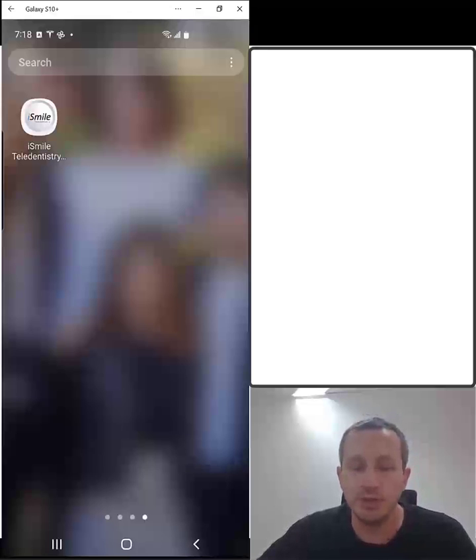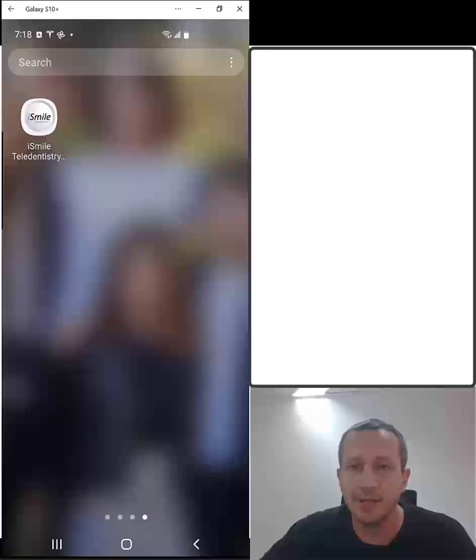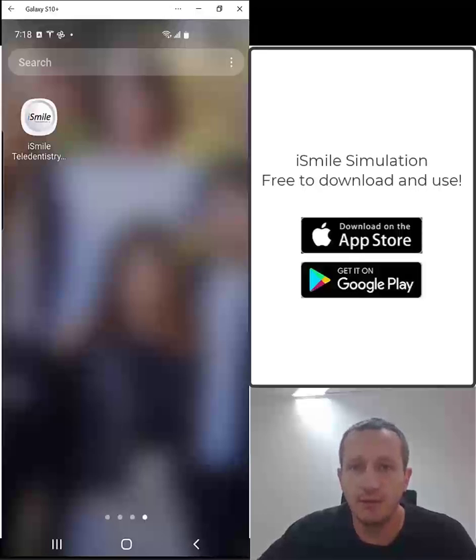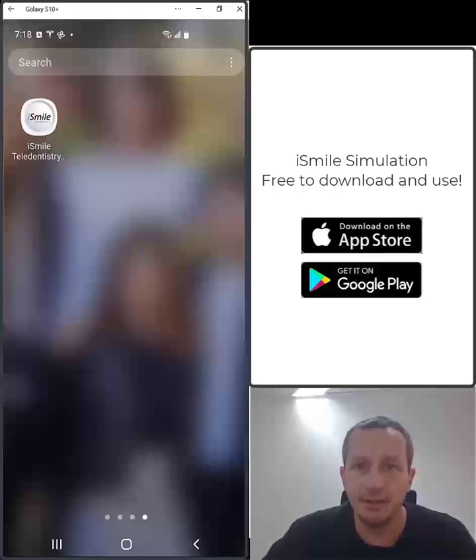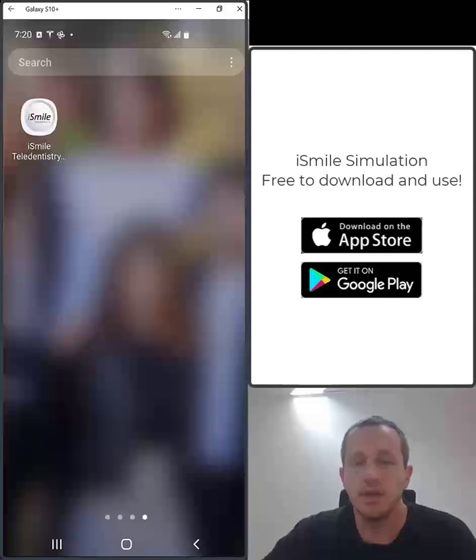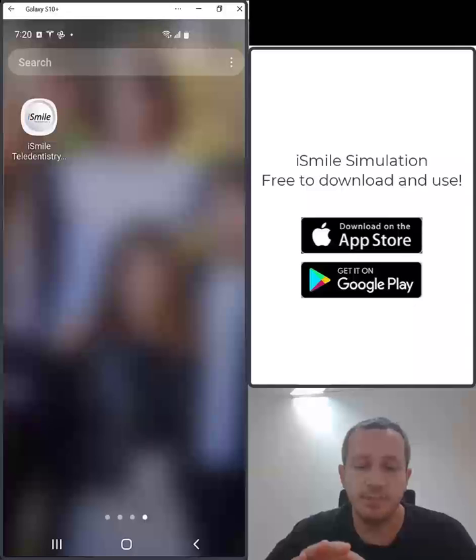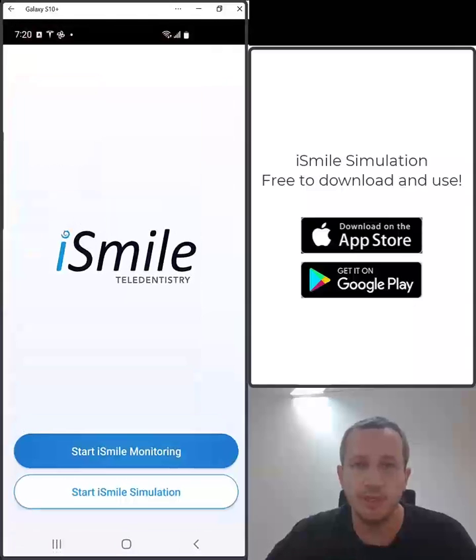I will demonstrate the functionality for you. The iSmile Teledentistry app is available for download from Google Play and from the Apple iOS App Store, so go ahead and download the app at no charge to get started. Once you have the app downloaded and installed, simply tap on the app to open it.